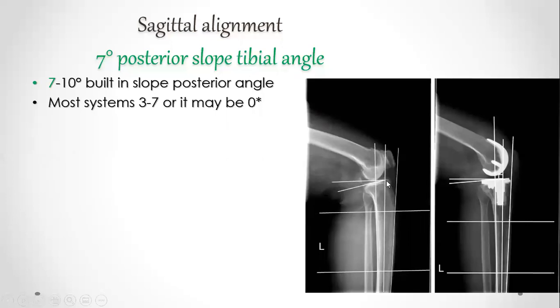So please keep in mind, when you are new in total knee arthroplasty, you have to phone the company guy, tell him to bring everything with him and make it on the sawbone first. Then see the same company, because many companies have some cutting boxes with 0 slope and some with 3 and 7 and so on.